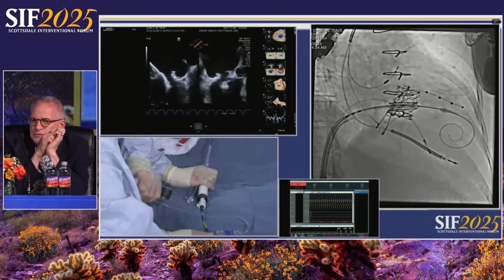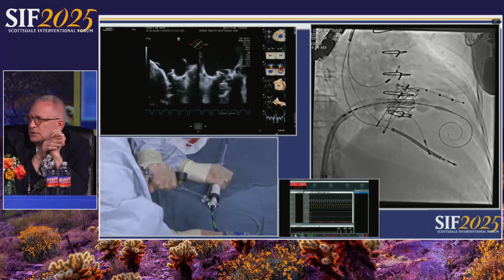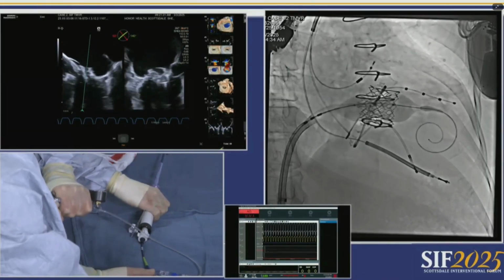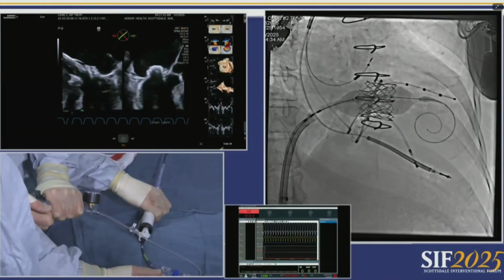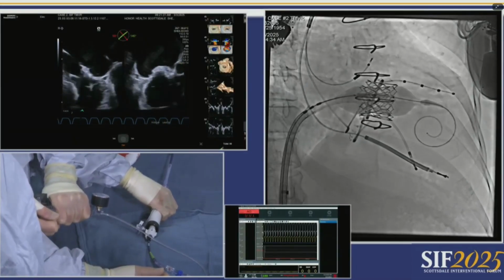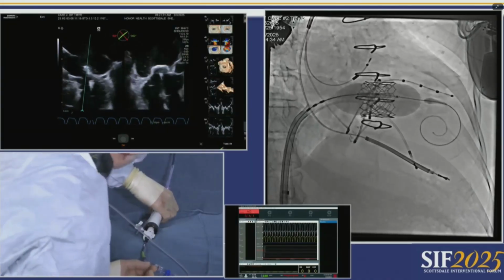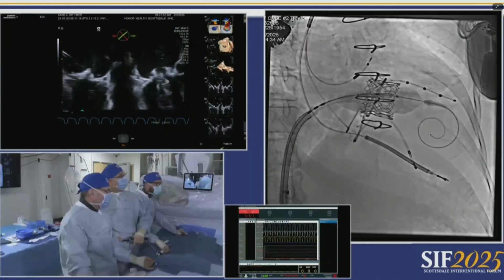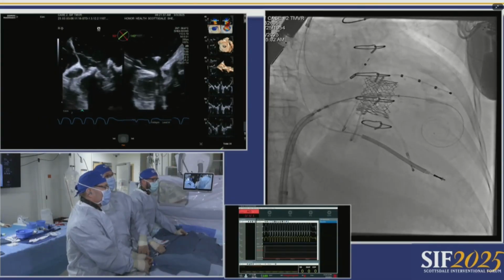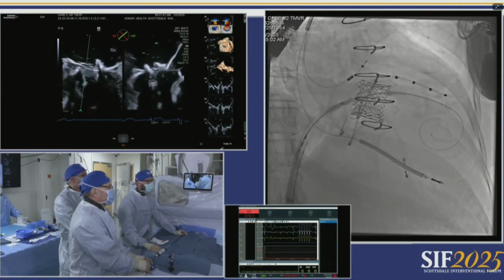Okay, so pacer on? You've got to accept the gradient you're going to get with a 23, but you'll have a 23 with no MR. That's perfect. Nice slow inflation here. Perfect. Push forward. Push a little forward. Good. Keep pushing. 1,000, 2,000, 3,000, 4,000. Time and down. Pacer off. That was all of the plus 3. Okay, walk it out, walk it back. Just don't keep the wire down.